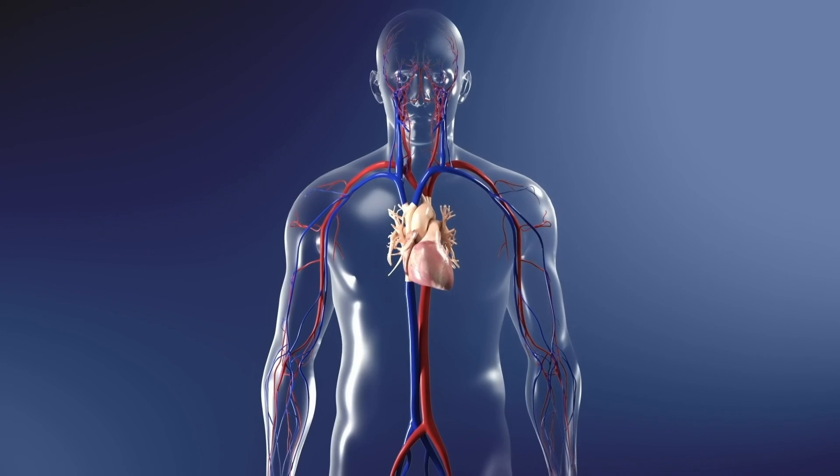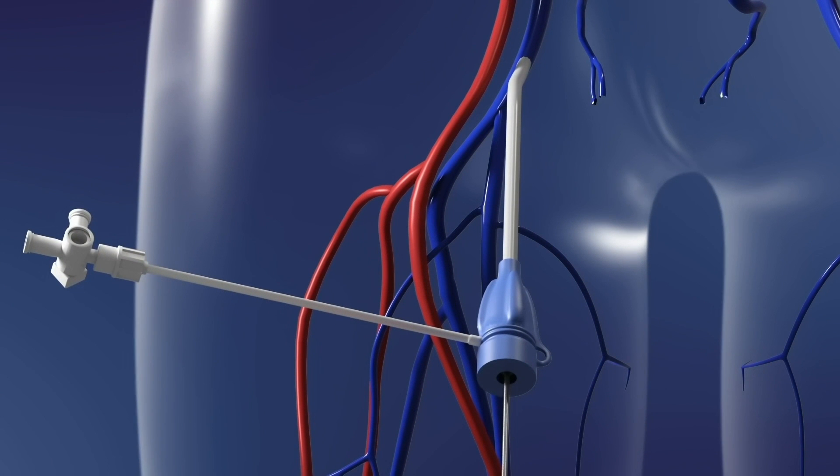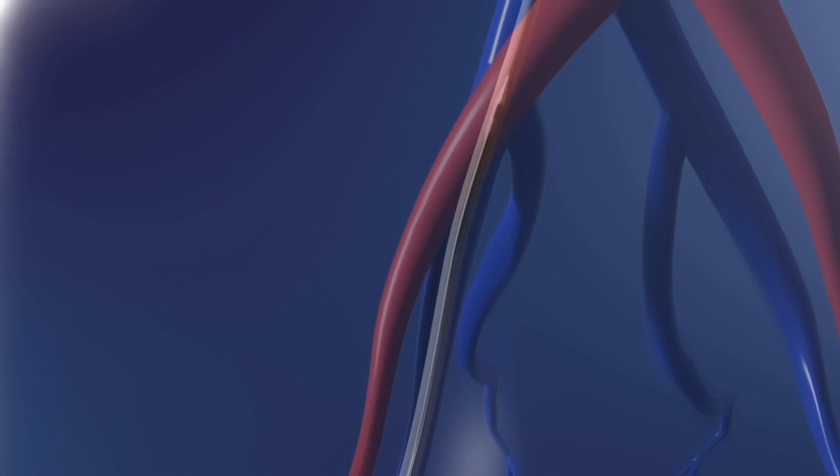The Alleviant device is intended to relieve excess pressure buildup within the heart that causes shortness of breath and reduced quality of life in patients with diastolic heart failure.